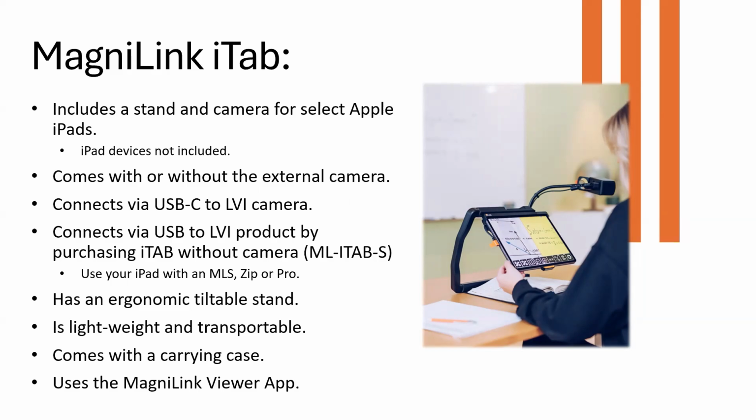Also, not that long ago, you couldn't plug one of our cameras directly into an iPad. Now you can, but it does zap some of that power from the iPad more quickly, so a student's not going to get through a 6 hour day. So what we've done in this stand, which is very unique from our tab stand, is that this particular stand has a plug-in on the back.